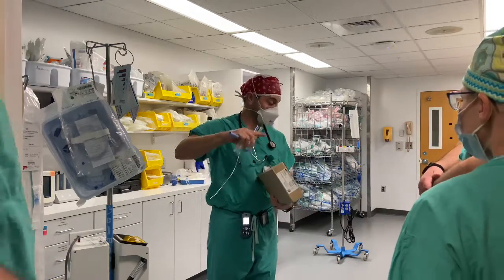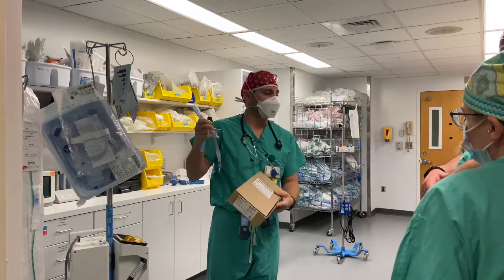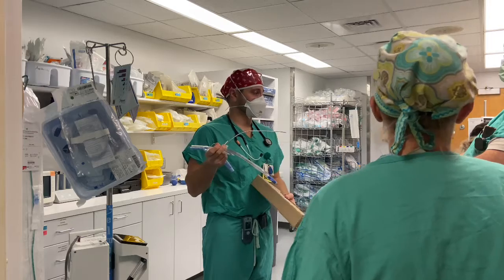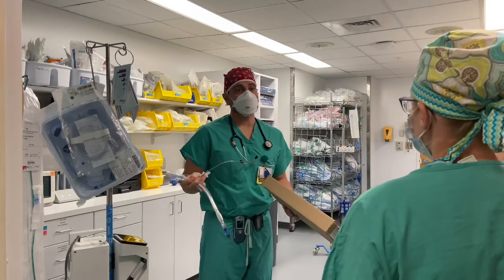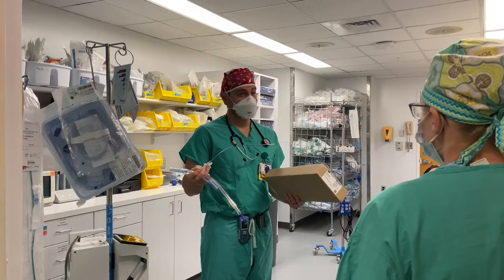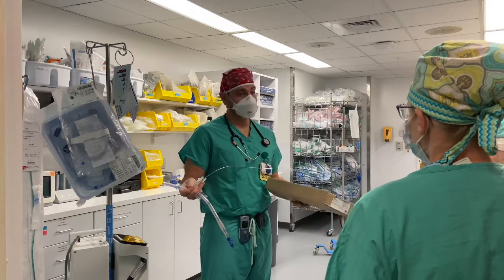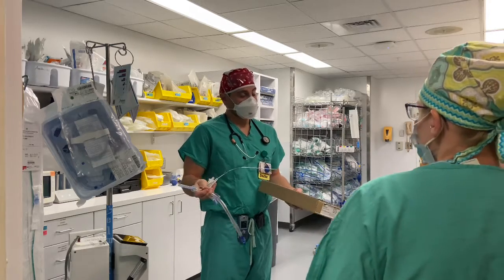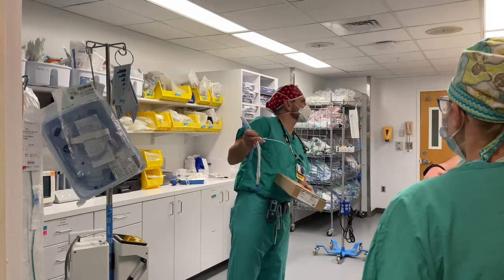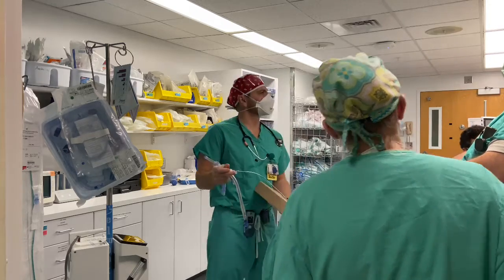So a couple things to talk about. 41, that just has to do with the size, okay? So in terms of sizing a double lumen tube, somebody full size, I'd put a 41 in. Somebody your size, I'd probably put a 35 in. So an average sized man is gonna be a 39 or a 41. Average sized woman is gonna be probably a 35 in most cases, sometimes a 37 if they're a little on the taller side. And rarely we'll use the smaller size. I think a 32 probably the smallest up there. I think they go down to like a 28 maybe, but you guys would know better than I do.